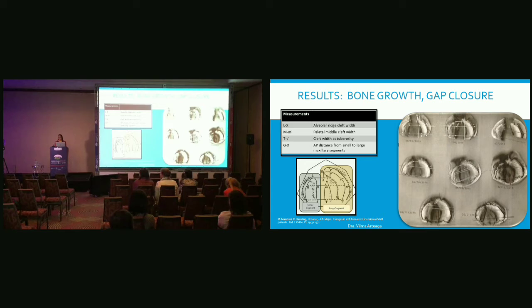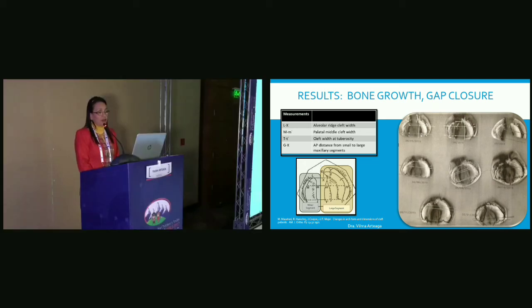And this serves a lot to motivate the caregiver or the parent, because once the parent and the caregiver sees that it is working by bone growth, they get so excited that they are more committed to use the treatment.